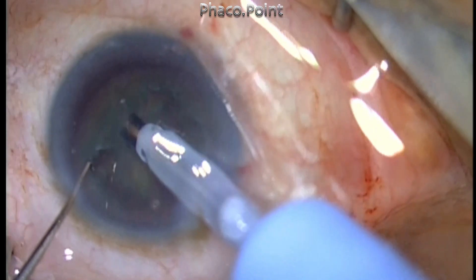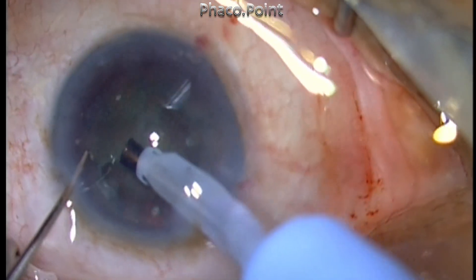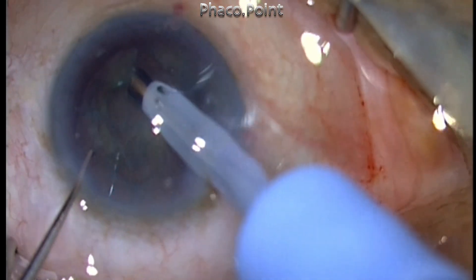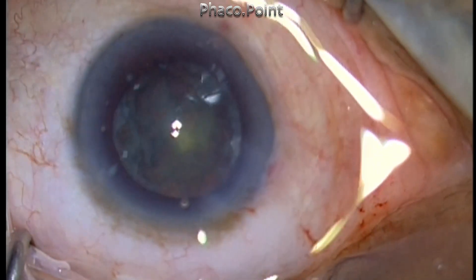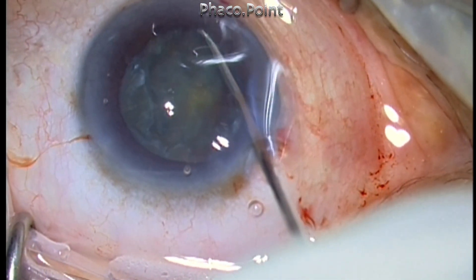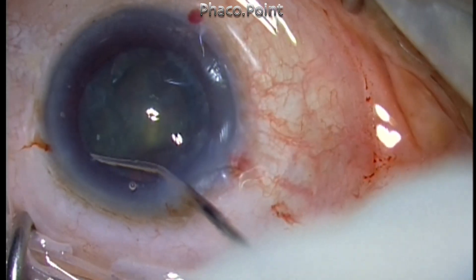There are several options for handling a soft cataract. You can use a horizontal chop using a blunt chopper and go to the periphery — that is one technique. But I would like to tell you a fail-safe method that works almost always in my hands, and that is to use a viscoelastic substance to create a visco dissection. This wave of viscoelastic will lift the nucleus up.